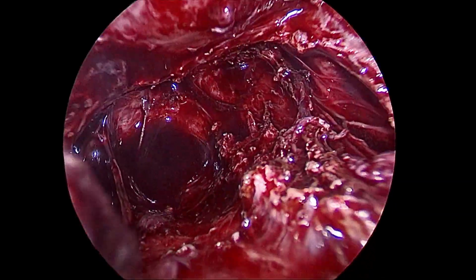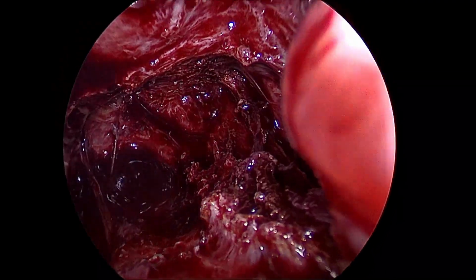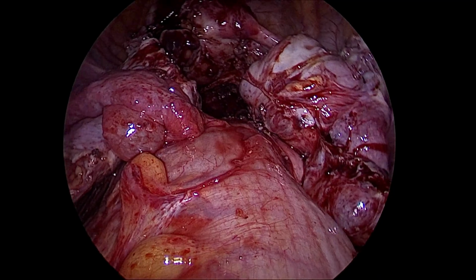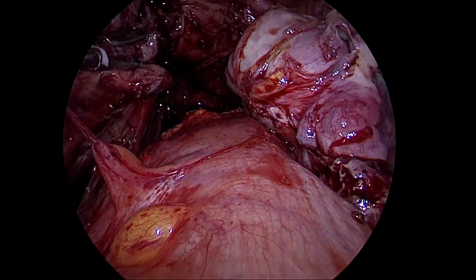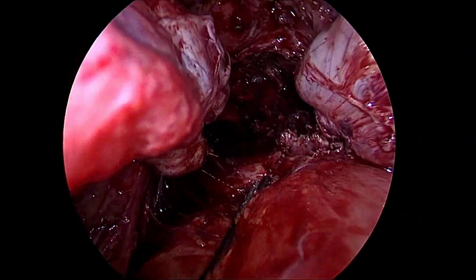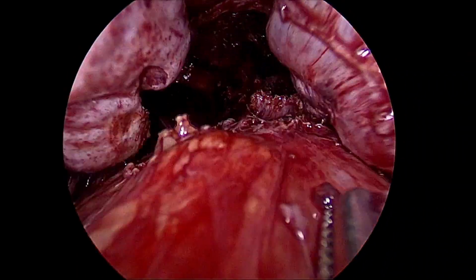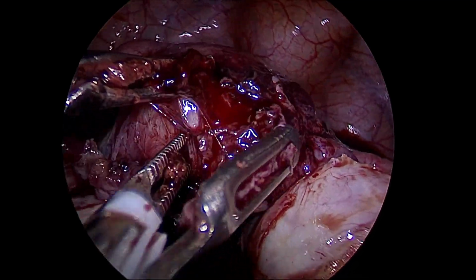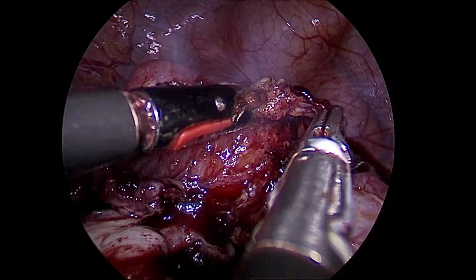Here, after seeing the overall dissection done, we checked for the hemostasis, and as you can see, till now we've not even used the suction. There was hardly 5 to 10 ml blood loss during the entire thing, and now we will be attempting to see for the patency of the fallopian tubes. What do you all feel? Will these tubes be open or will not be open? Will she be having a blockage or will she be having the fallopian tubes open?